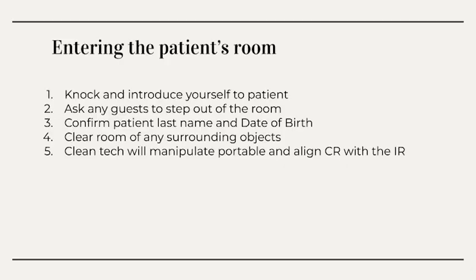Entering the patient's room. Knock and introduce yourself to the patient. Ask any guest to step out of the room. Confirm patient last name and date of birth. Clear room of any surrounding objects. The clean tech will manipulate the portable and align the CR with the IR.